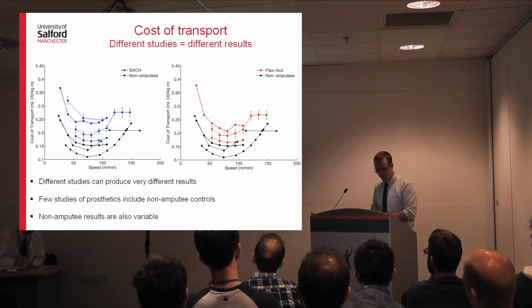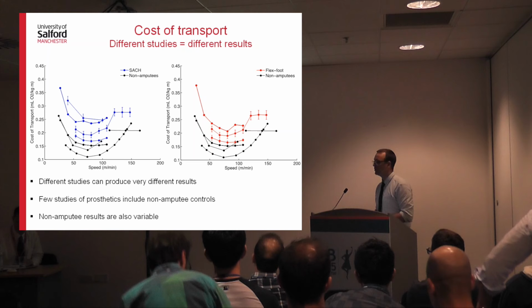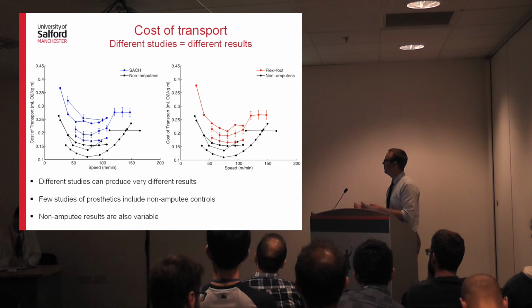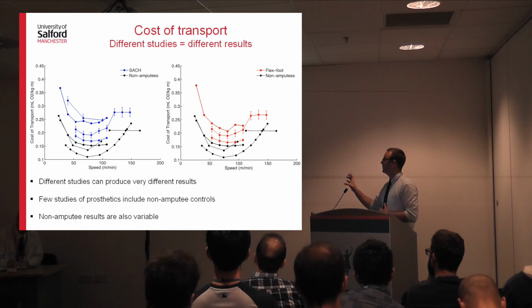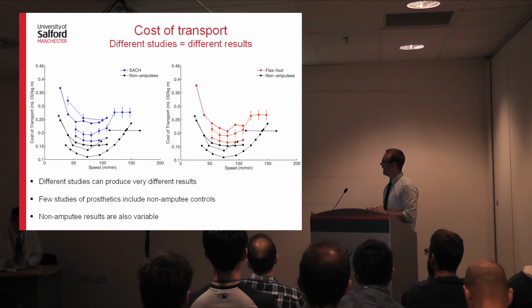And one difficulty we come across when we're trying to compare different studies with each other is not many studies of prosthetic feet actually include a non-amputee control group. So that makes comparing the results of one study with another very difficult, because a non-amputee group would be one way to normalize the data, but that's often not available. And as you can see, actually, the non-amputee results themselves are variable. And these differences come about just to do with the group that you have, so the subjects you're using in your experiment, or protocol differences, or perhaps the equipment you're using.